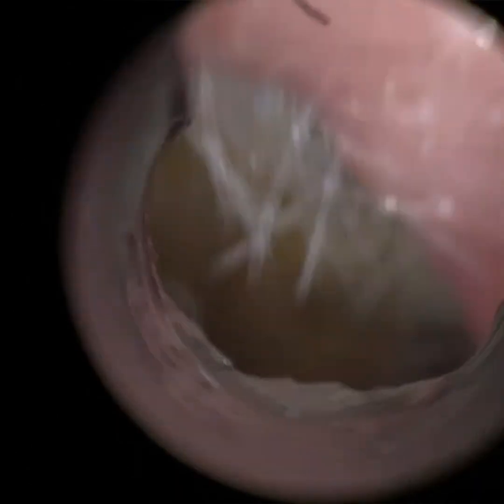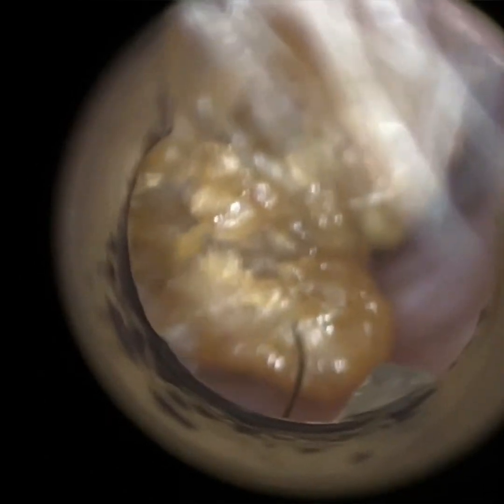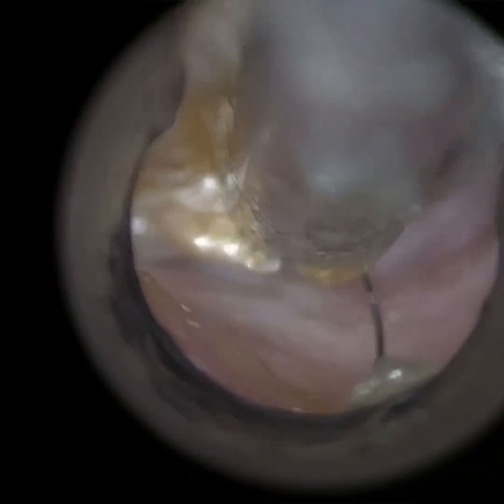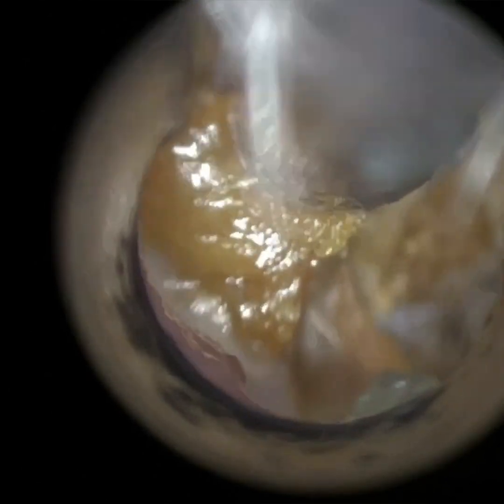So you can see there's a lot of bilateral integration — coordination between both hands. The endoscope also has to be at a specific location in the ear to allow instrument insertion. If it's in the northern hemisphere of the ear canal, it will obstruct access. You have to position it lower down, which can be tricky. When people struggle and can't use the endoscope, they revert to other means: either an operating ENT microscope, or headworn loops or headworn microscopes.